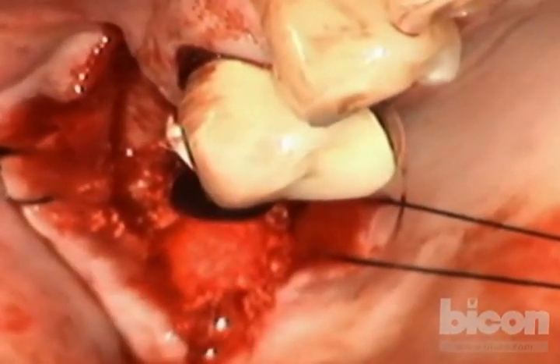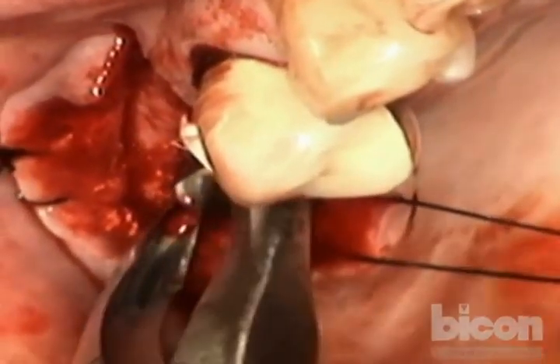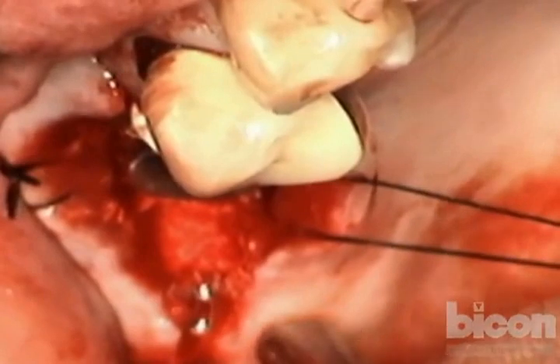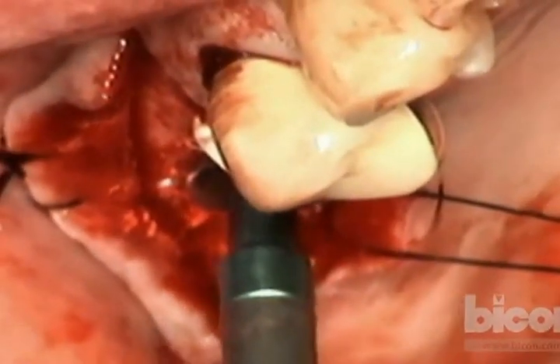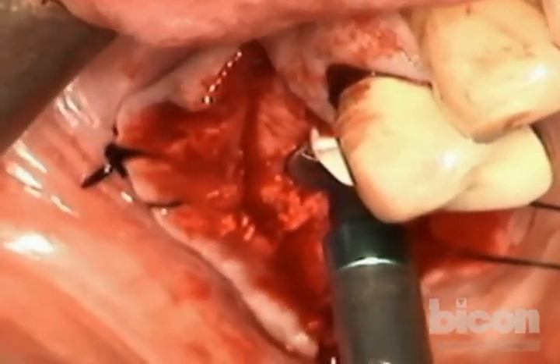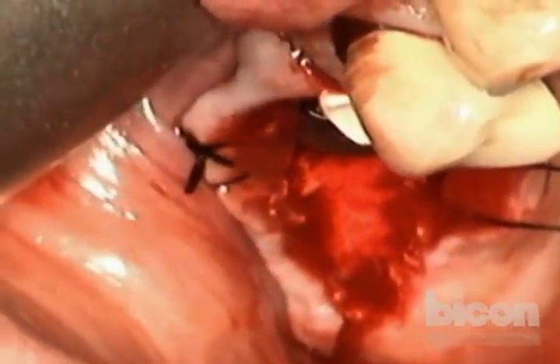And the decision I have to make now is what's the best orientation for this oblong type of abutment. And I think having the longer side oriented buccally palatally will be better, because of the way the bone architecture is. Now, I will take the inserting point, which sits in a groove right at the center of the top of this abutment, and will place it to the full depth. The sinus lift abutment then prevents the implant from freely floating into the sinus. Also will give it added stability by engaging the crestal bone. And because of its design, will make it exactly at 2 millimeter depth.